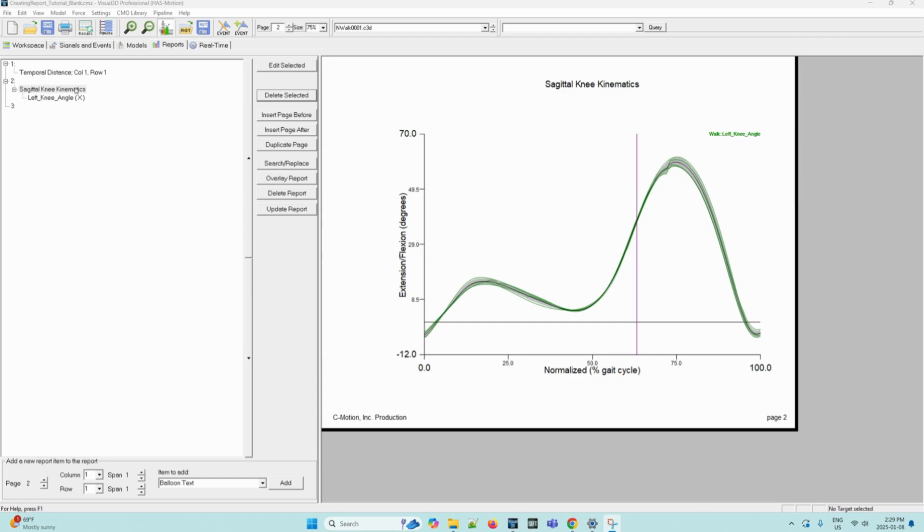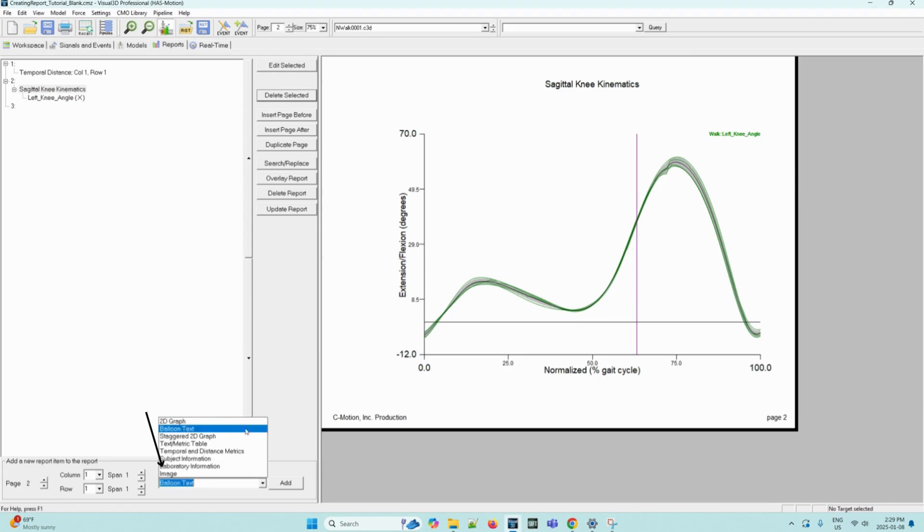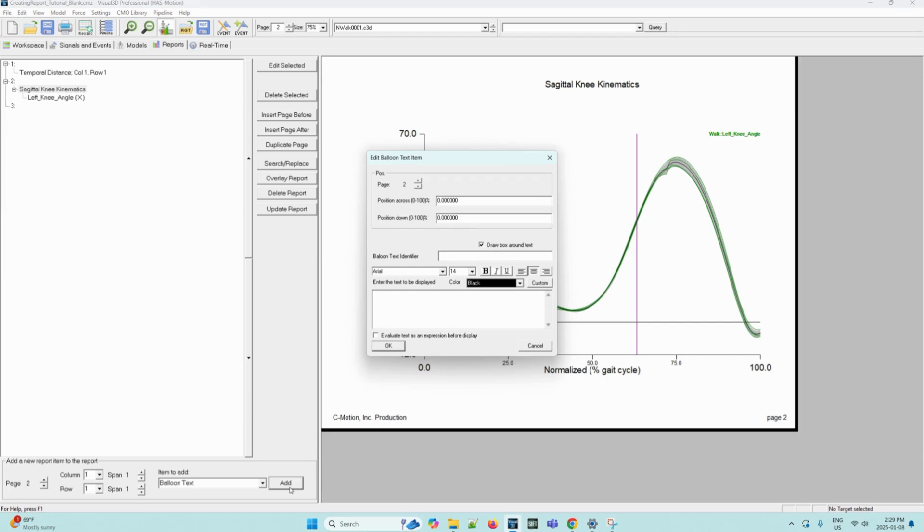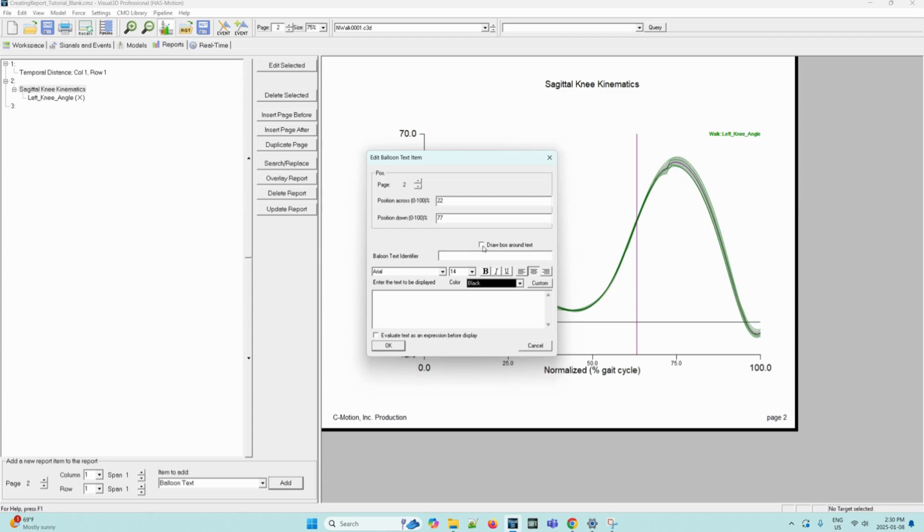We can add balloon text to this page. And so to do this, in the item to add dropdown, we can select balloon text and press add. The edit balloon text item dialog box will appear here. Now we can fill in certain items. So the page will stay at 2. The position across will be 22. And the position down will be 77. And then we can uncheck the draw box around text. The balloon text identifier will be set to LHS 1. And the text to be displayed will be LHS. Then we can press OK.